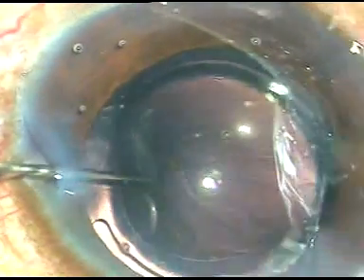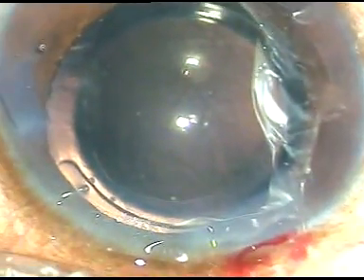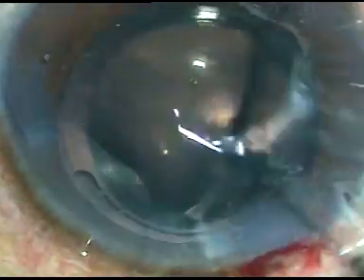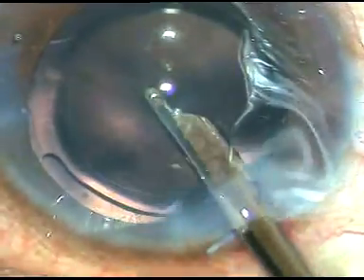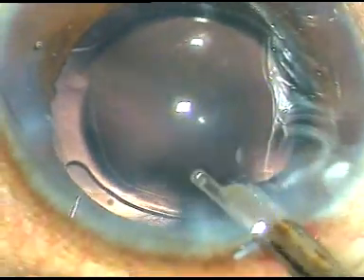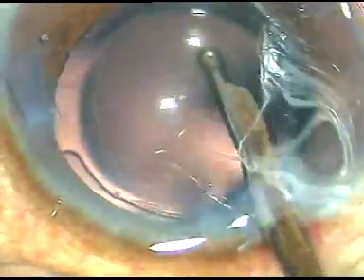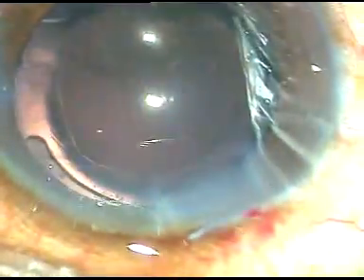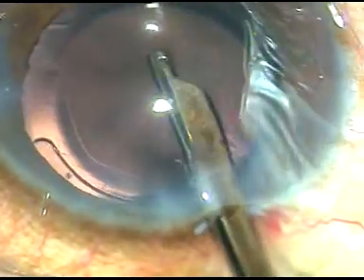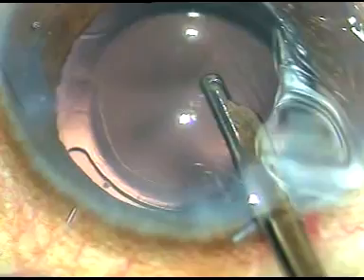This is moxifloxacin. There's a lot of controversy whether we should use moxifloxacin intracamerally or not. I just take the middle path like Buddhism. I inject moxifloxacin and I wash it out. I call it a moxie lavage. I never have TASS with this method.